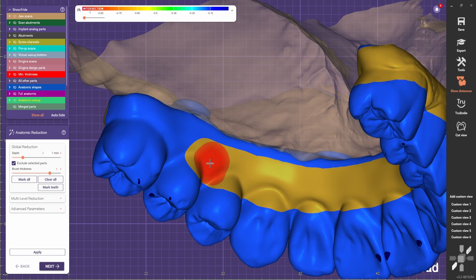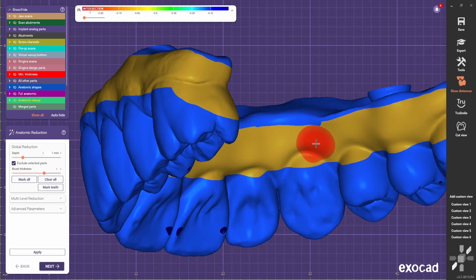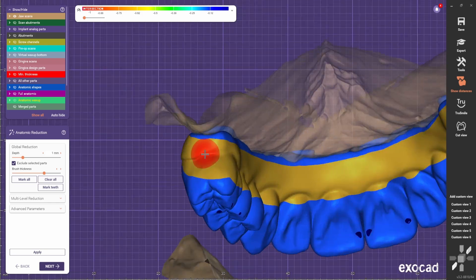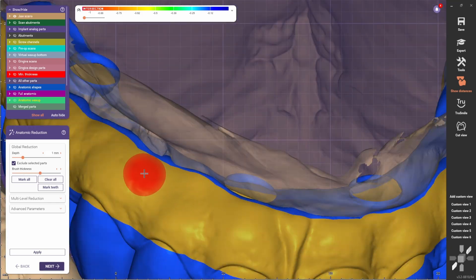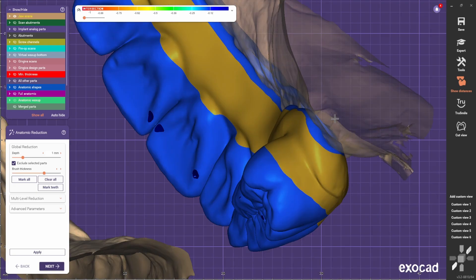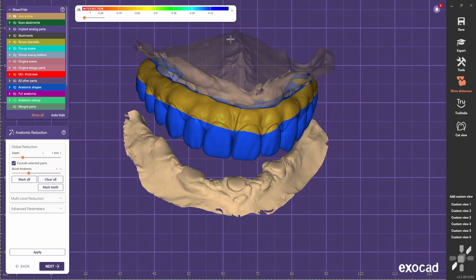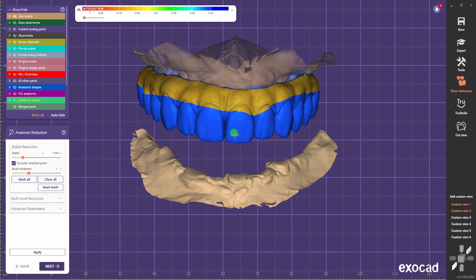In the palatal area you don't need to go as deep — just make the margin further away from the soft tissue. After defining the margin, do the reduction. Don't forget to match this number with the one you see here, otherwise it's going to reduce the gingival part less than the tooth part.